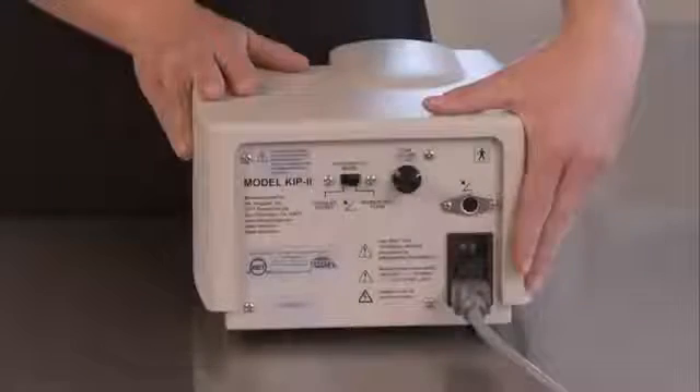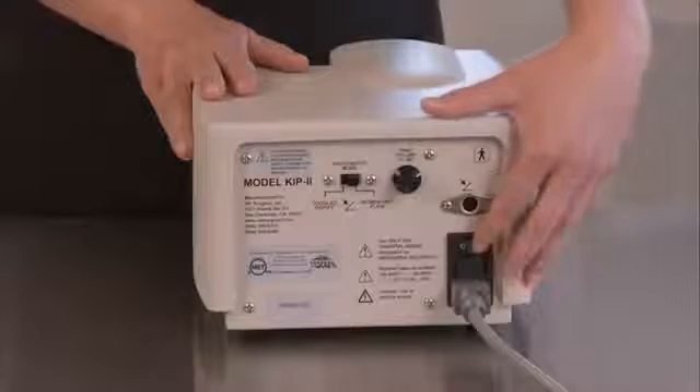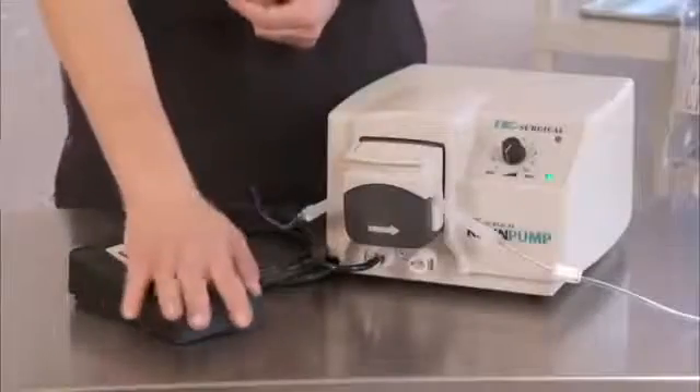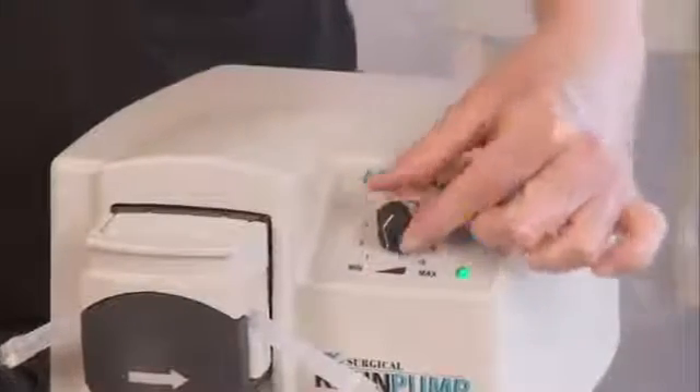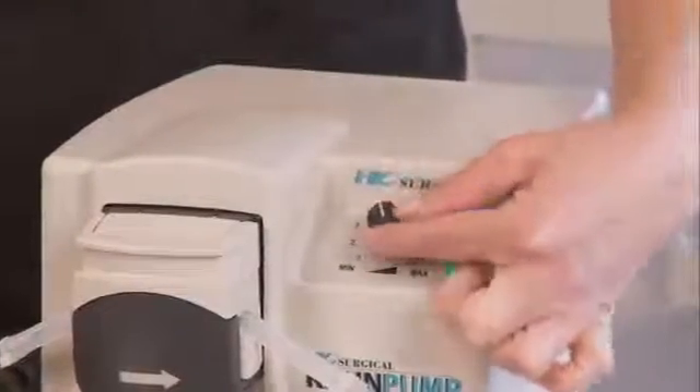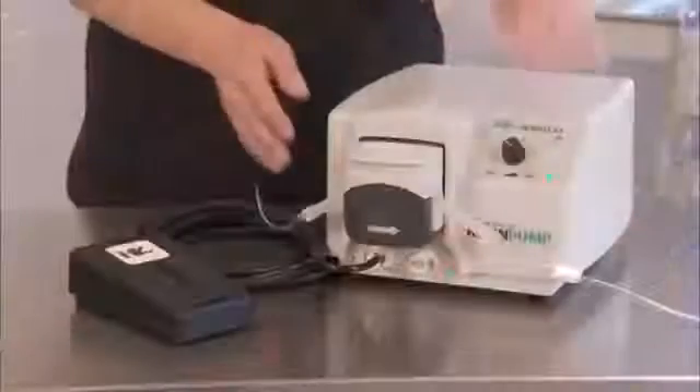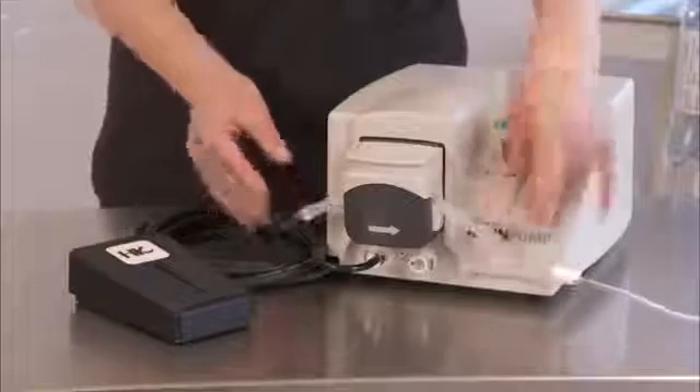Problem: inadequate flow when the foot pedal is pressed. Possible causes: speed control is set too low, or the wrong tubing is in the pump. Solutions: press the foot pedal to turn the infiltration pump on, turn the speed control clockwise to increase the speed, turn the pump to 5 and then back down again to the desired setting. Only use tubing specified by HK Surgical.